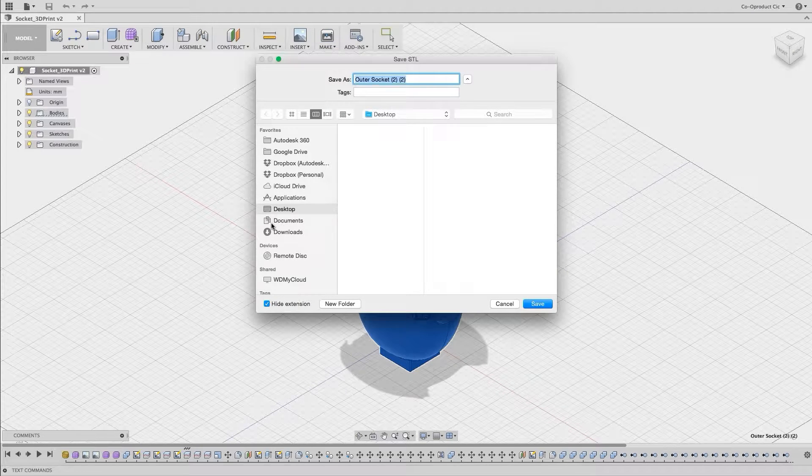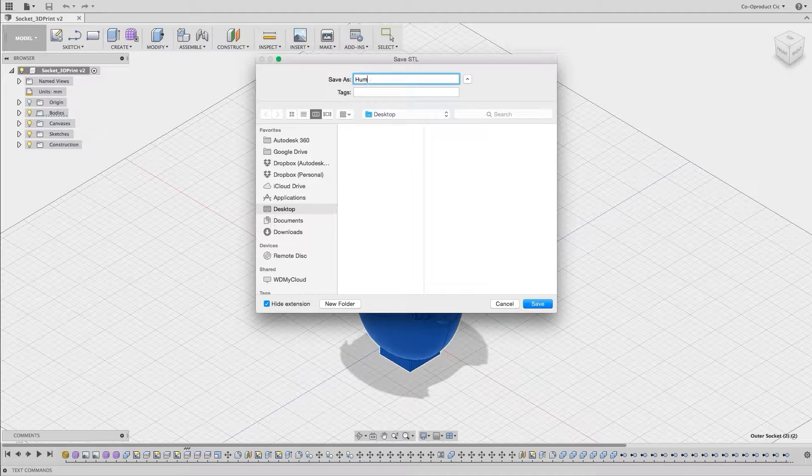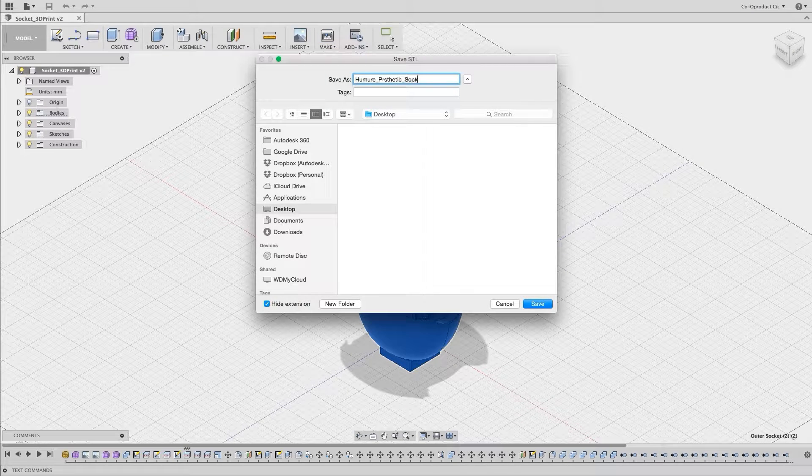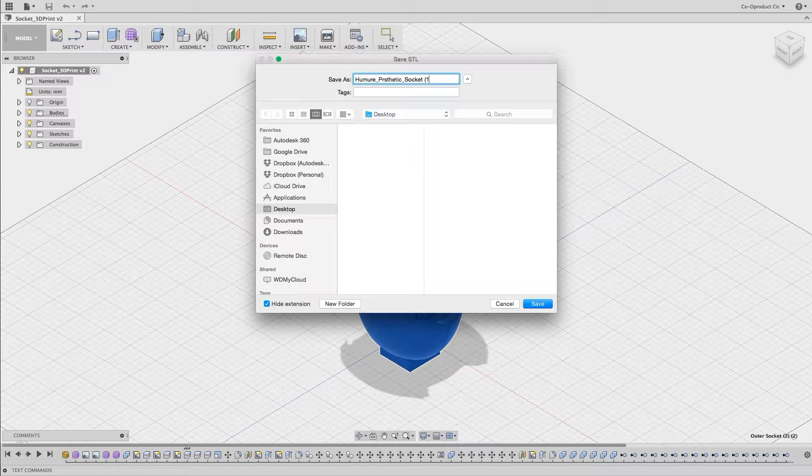When we've done this, we need to choose a location to save our new STL file, give it a name, and then click Save.